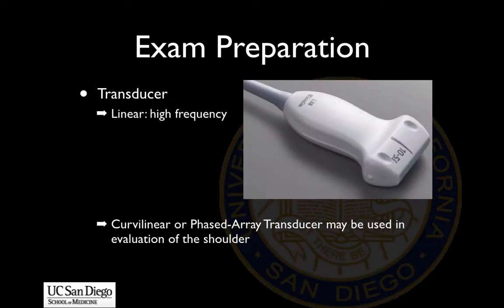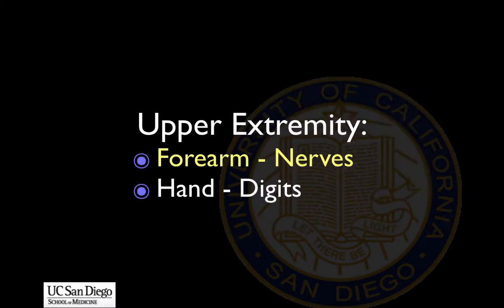For most musculoskeletal exams, the high-frequency linear transducer will be used during scanning. We will next discuss the appearance of nerves in the forearm.